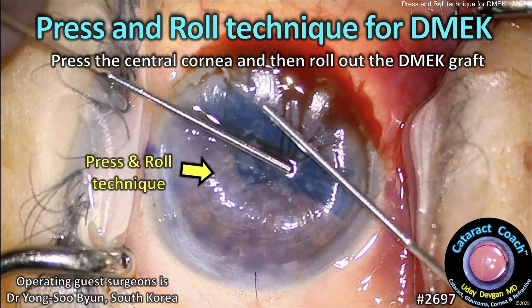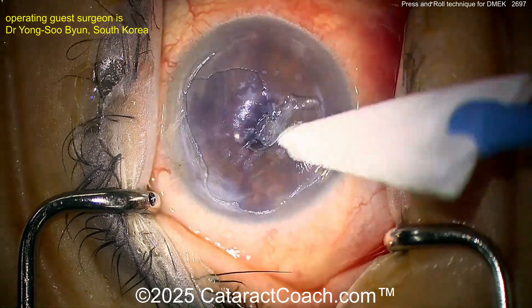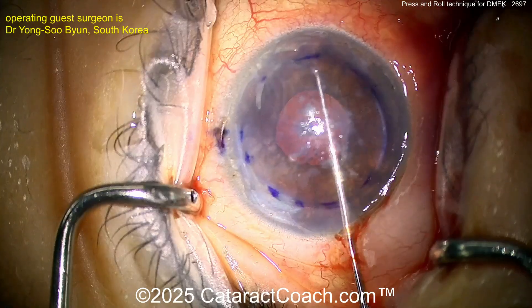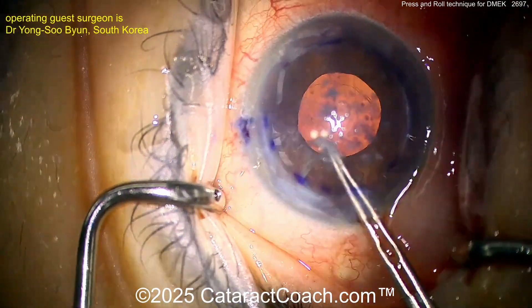From cataractcoach.com, this is the press and roll technique for DMEK — pressing the center cornea and rolling out the DMEK graft using a special air bubble. This is a very interesting technique. The patient has granular dystrophy, has already had a vitrectomy making it more challenging, with a very deep AC, and is already pseudophakic.